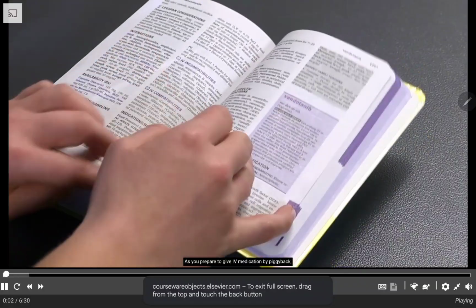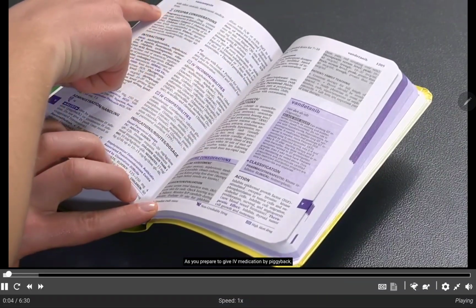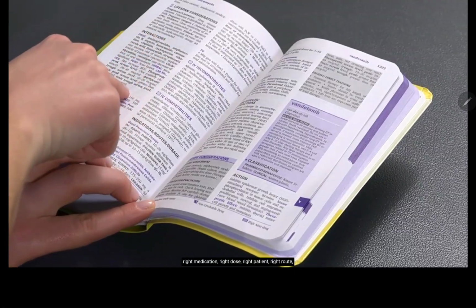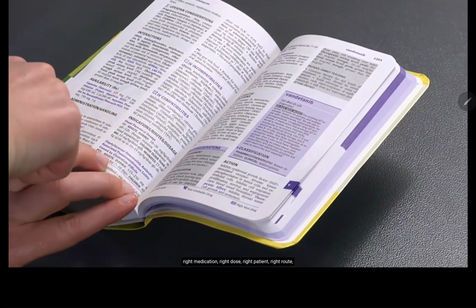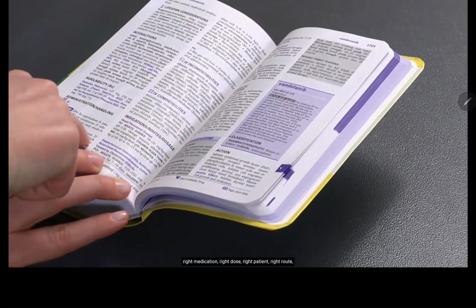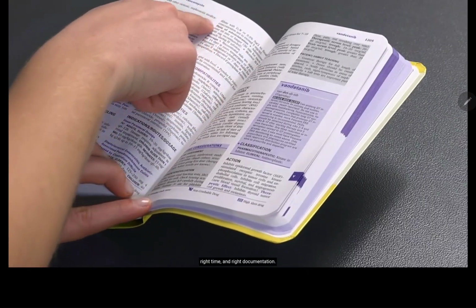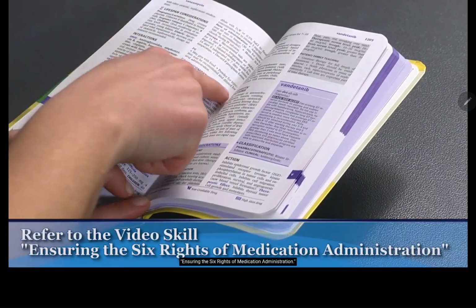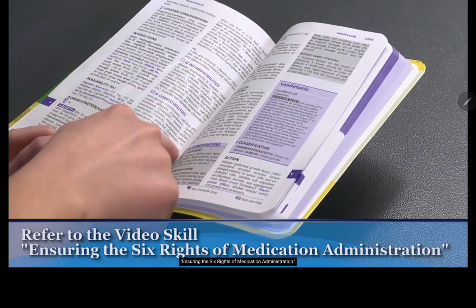As you prepare to give IV medication by piggyback, keep in mind the 6 rights of medication administration: right medication, right dose, right patient, right route, right time, and right documentation. See the video skill ensuring the 6 rights of medication administration.